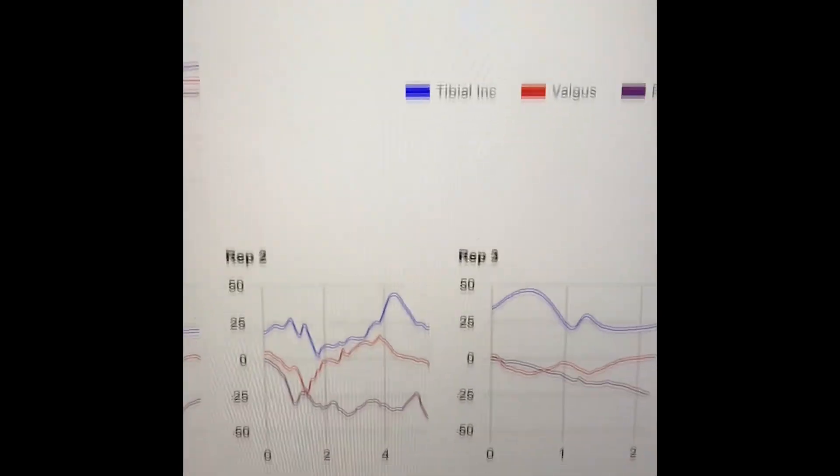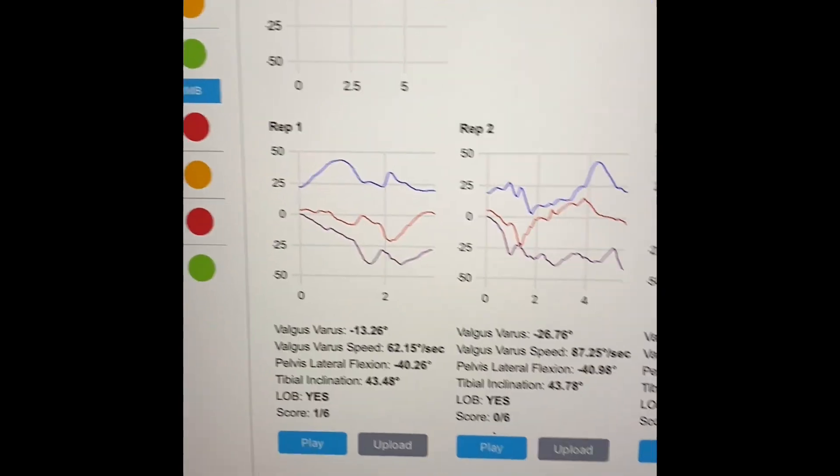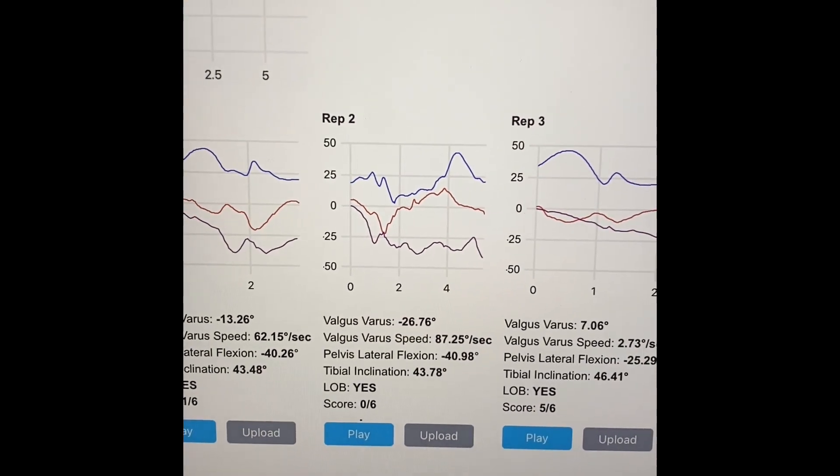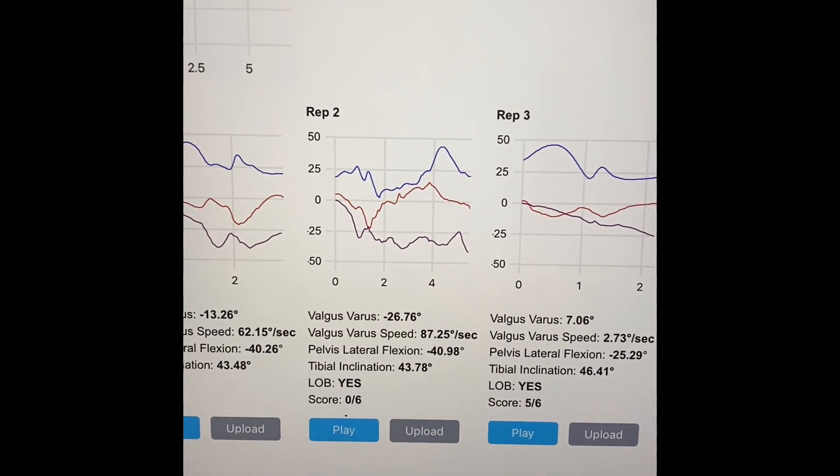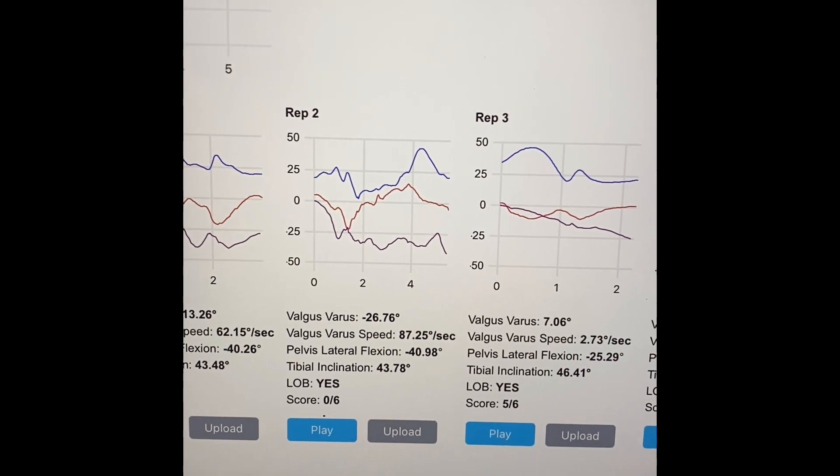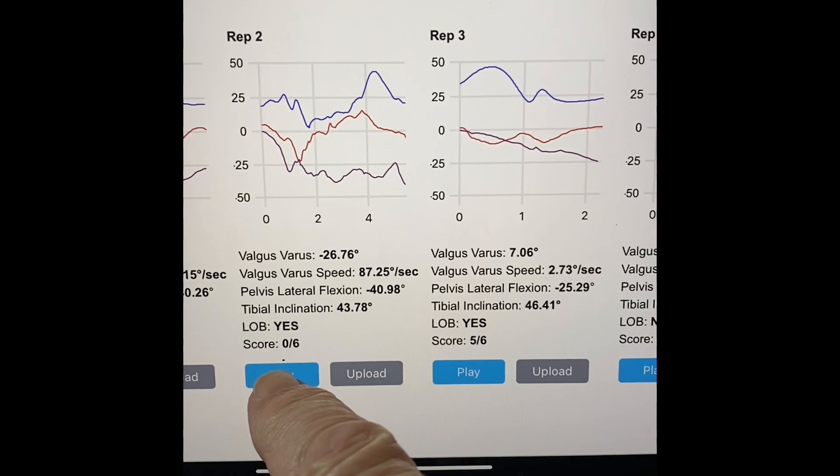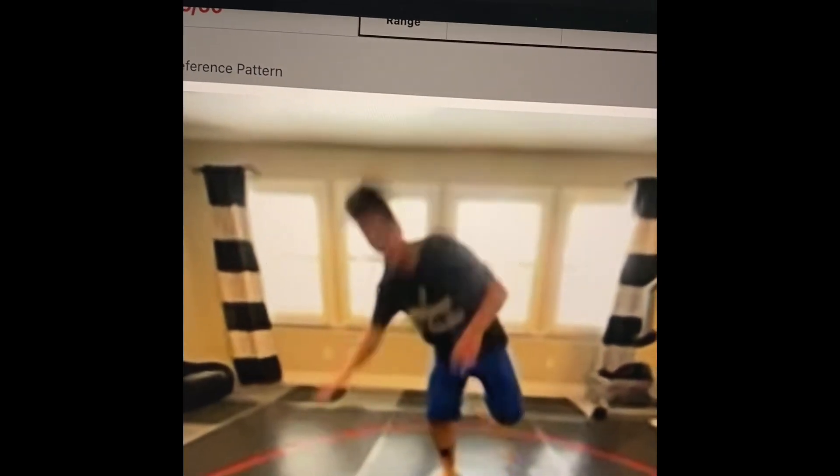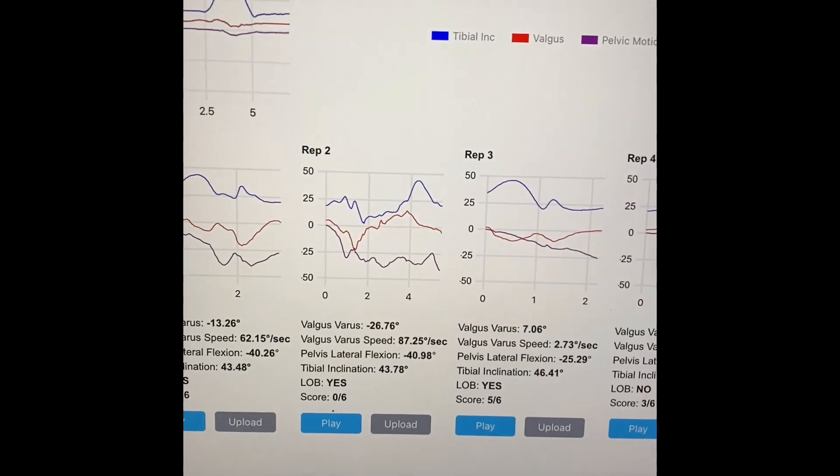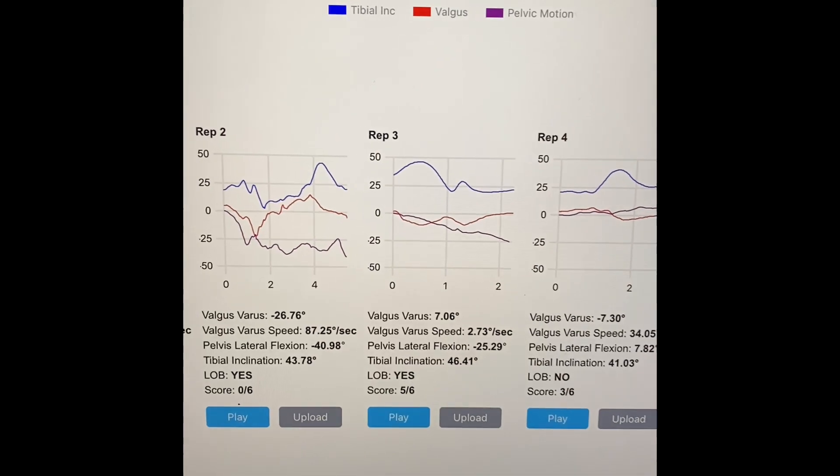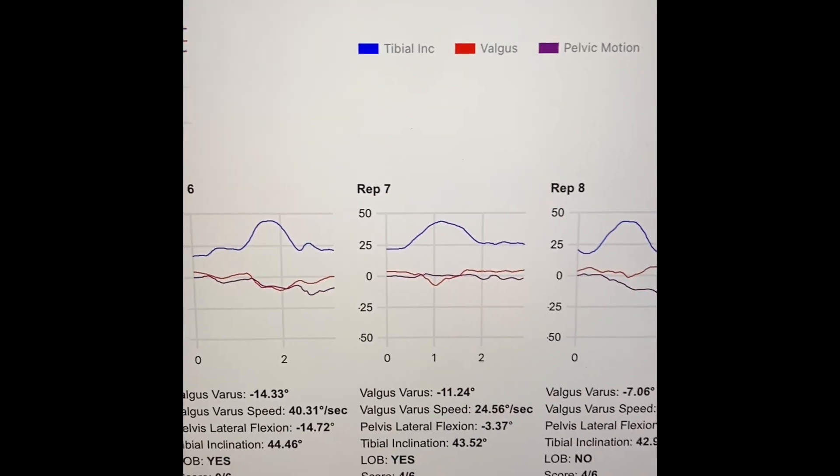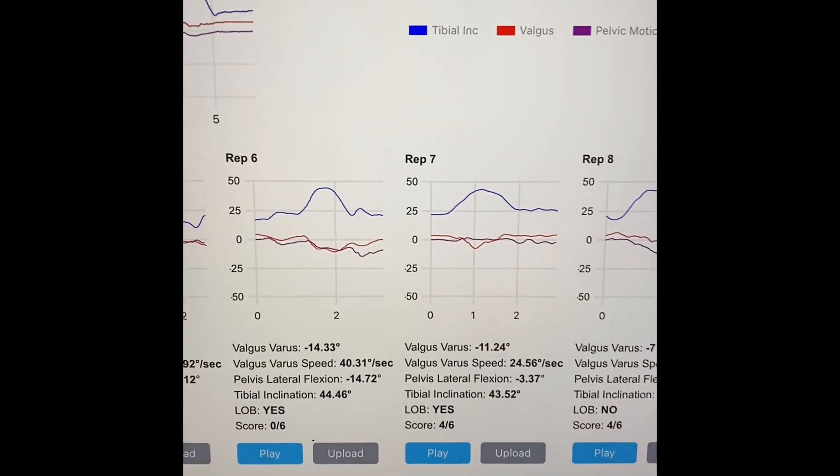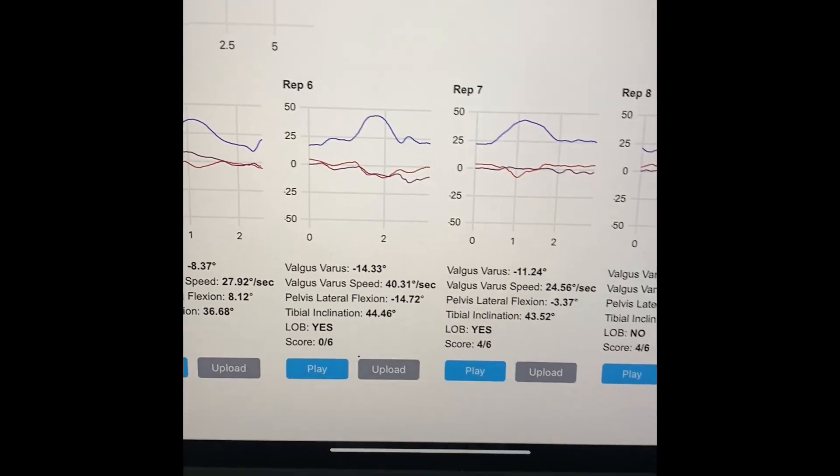Now here's where we get some really cool stuff. So I can take a look at each one of the individual movements. I can see where his valgus was greatest, where his speed of valgus was greatest. And then what I can actually do is hit play and I can actually see what that individual movement looked like. So obviously he did not do very well on that particular motion and we can see that recorded. So you can actually see that by individual rep as we scroll across the screen. And again, all you would have to do is hit that play button to view the individual repetition.